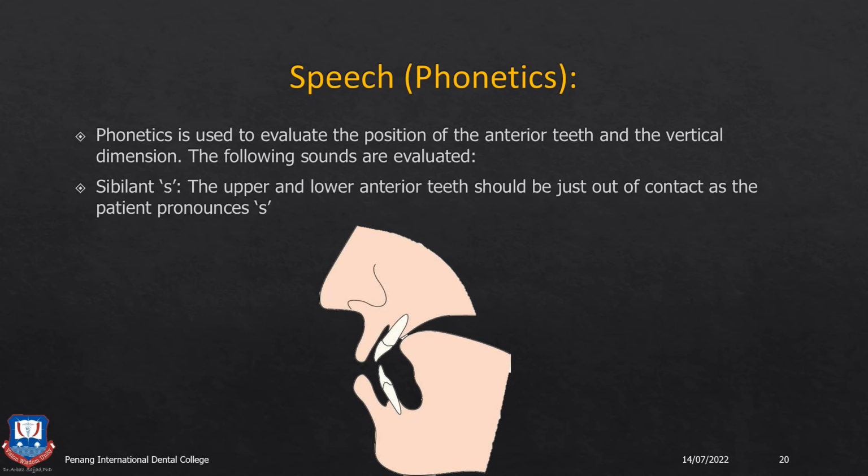This is very easy. Sibilants are basically, you should remember, S for sibilant. So any words that begin with S, that is when the upper and lower teeth come very near each other, that is the Silverman's closest speaking space. So when the patient says S, this results in the escape of air from between the palatal vault and the superior border or superior surface of the tongue, resulting in the pronunciation of S.